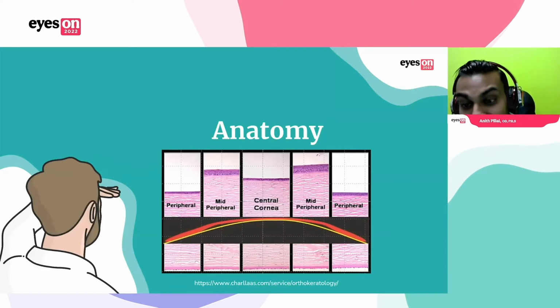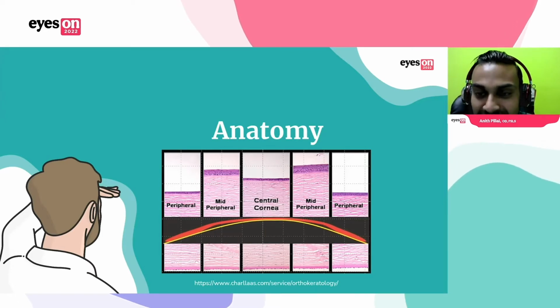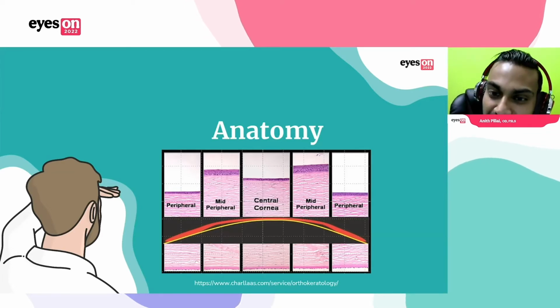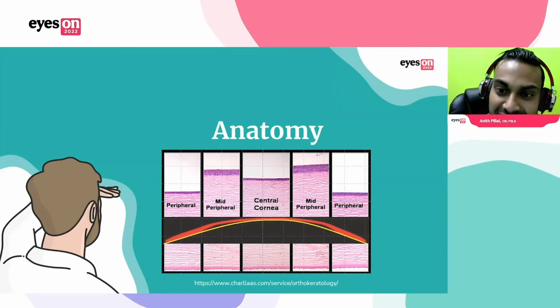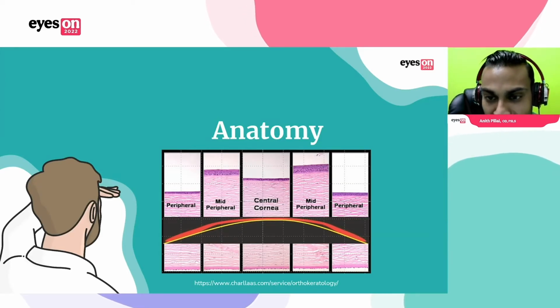And this is, again, another histology slide. I think it might be the last one here, but it's depicting not only that those cells are migrating, but they're also swelling up in that mid-periphery. So there are more cells in the mid-periphery, and they're also thicker. In that central area, there are fewer, and they've also been thinned out. That's accomplished by the hydraulic forces from the fluid reservoir of an Ortho-K design.